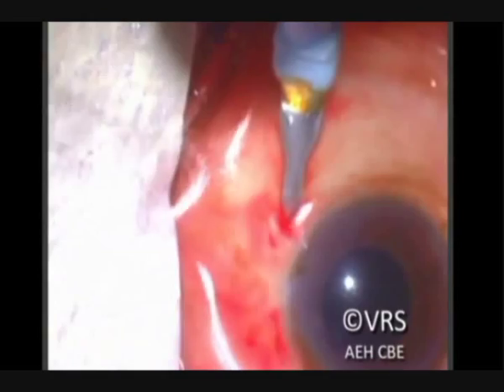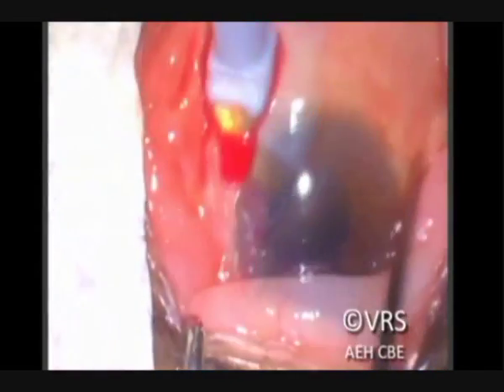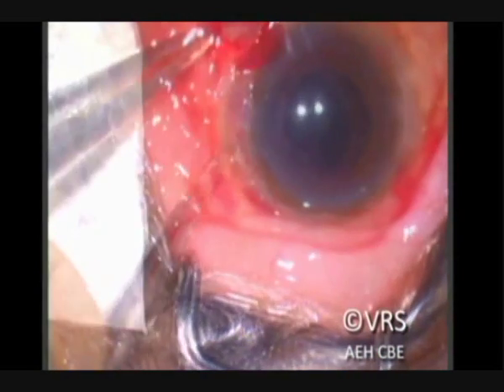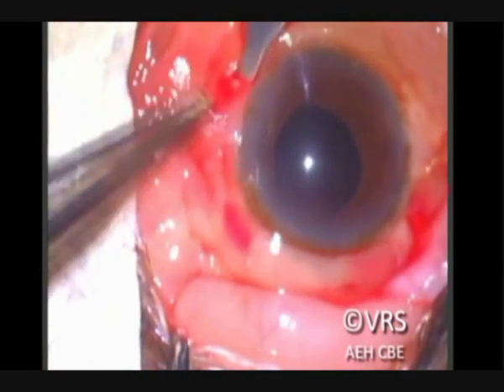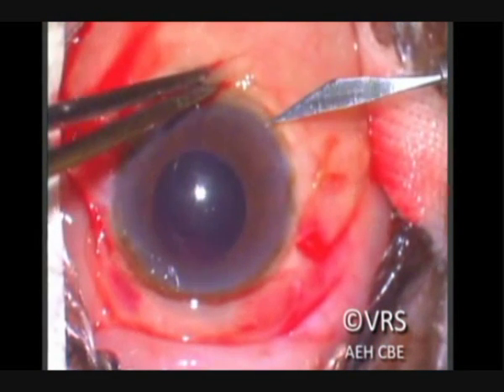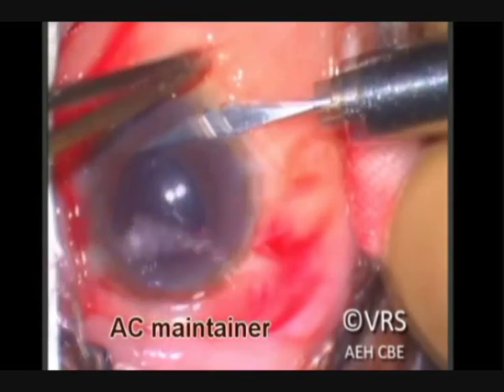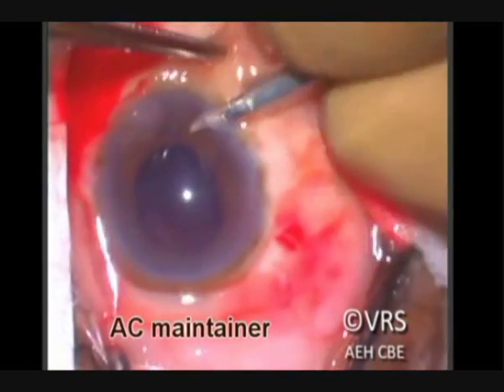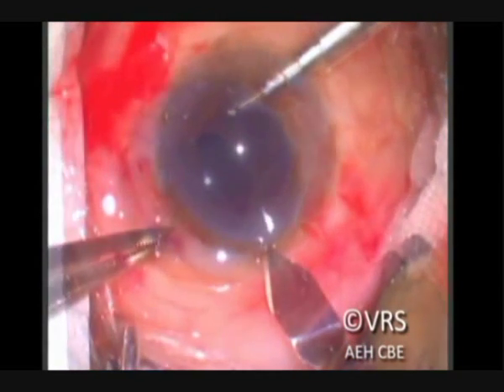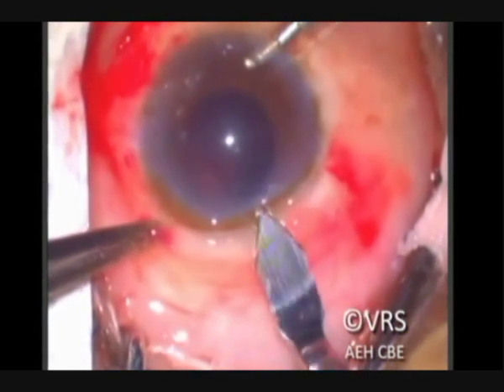If you have difficulty, the conjunctiva can be opened and this tunnel can be constructed under direct visualization. To maintain the globe pressure during the surgery, an anterior chamber maintainer is placed, which helps to maintain the globe tonus throughout the surgery. Because we are inserting a foldable IOL, a 3 mm keratome is used to construct a corneal tunnel.